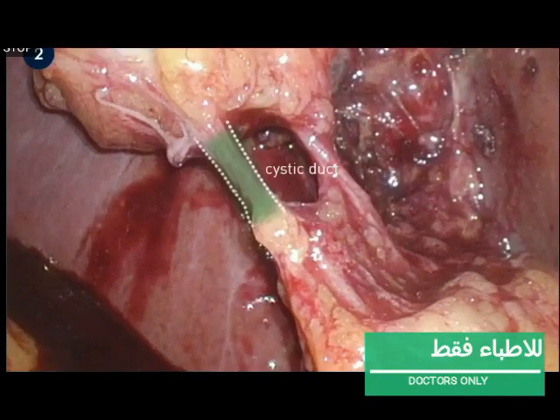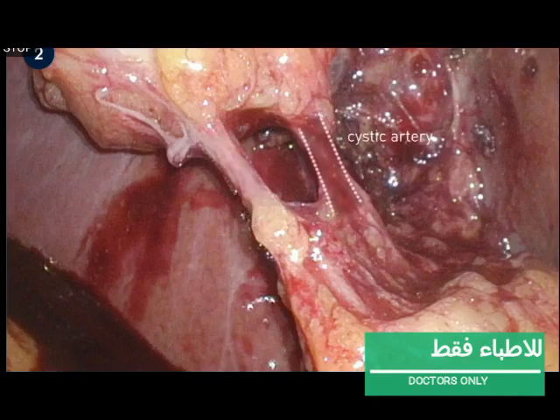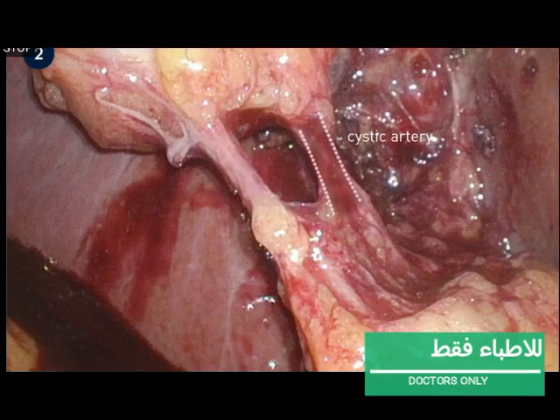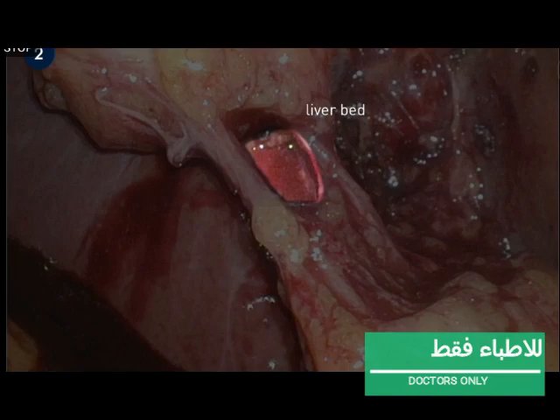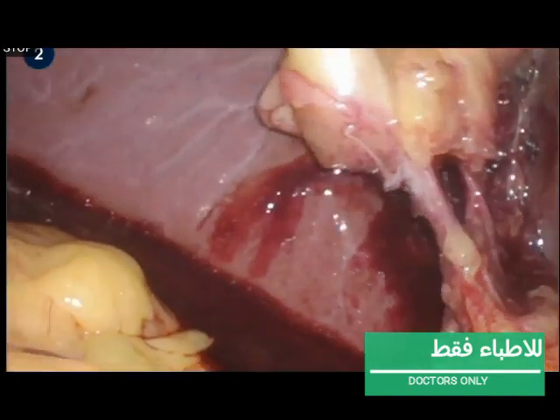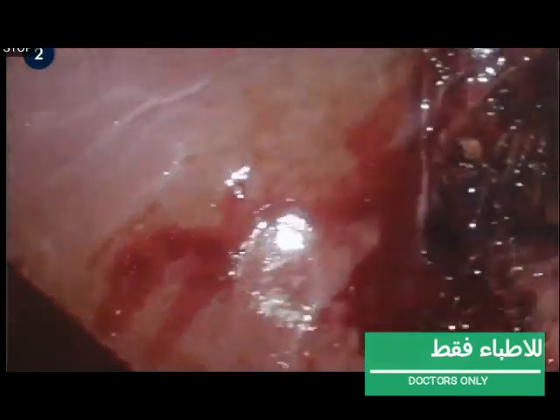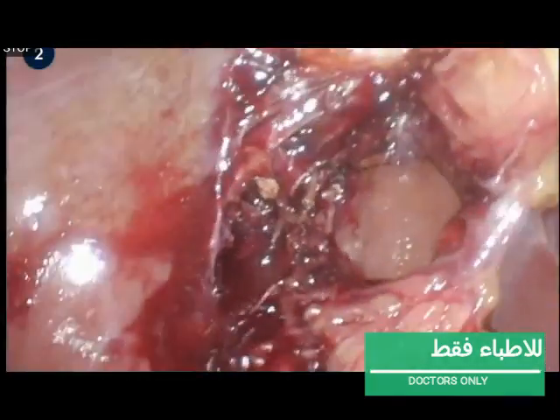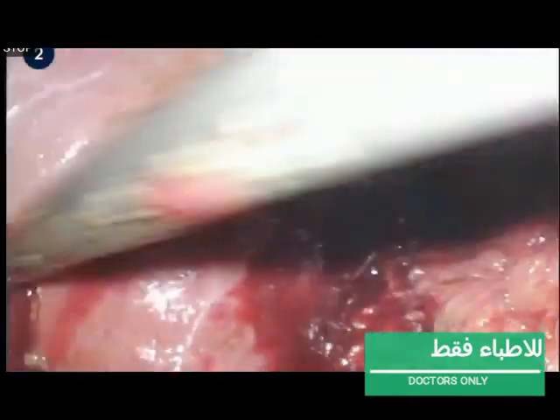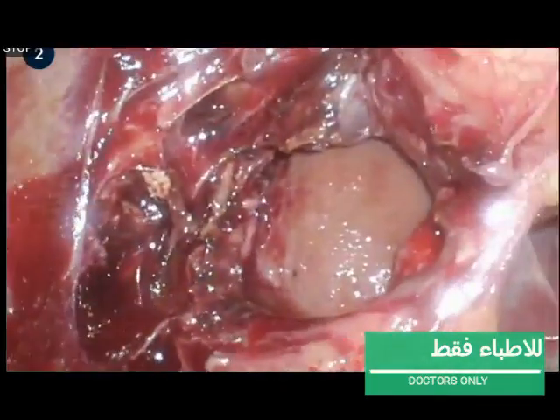This overview shows a thin cystic duct, the cystic artery, and the liver bed in the background, with no other structures in between. The critical view of safety needs to be visualised from both sides. If this is not possible, a conversion to an open procedure should be considered.